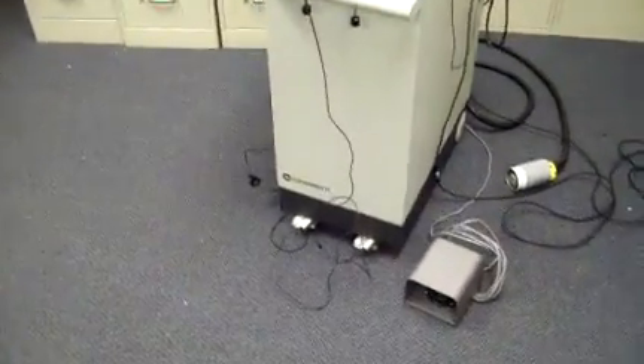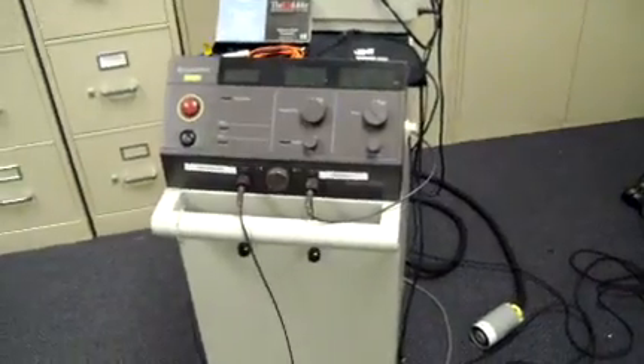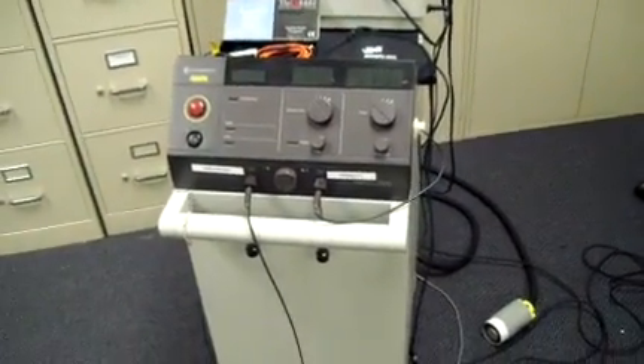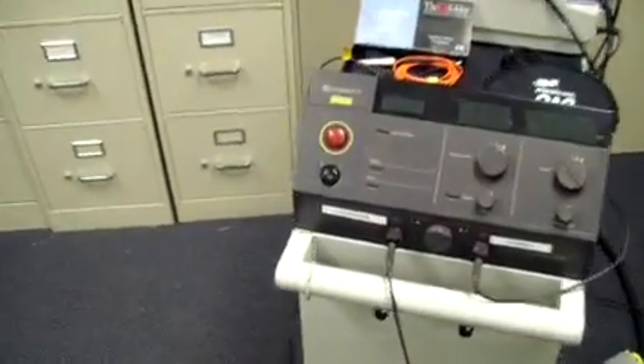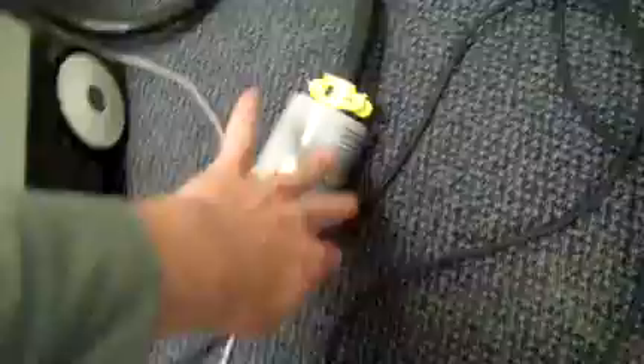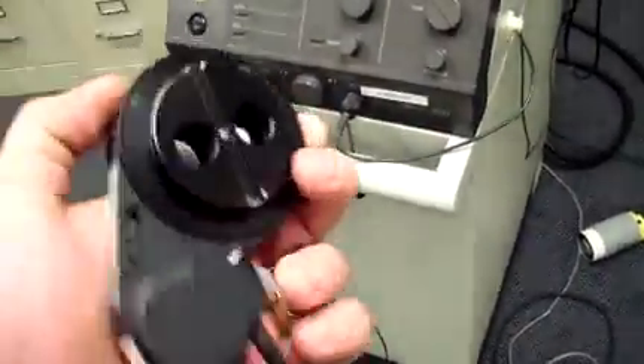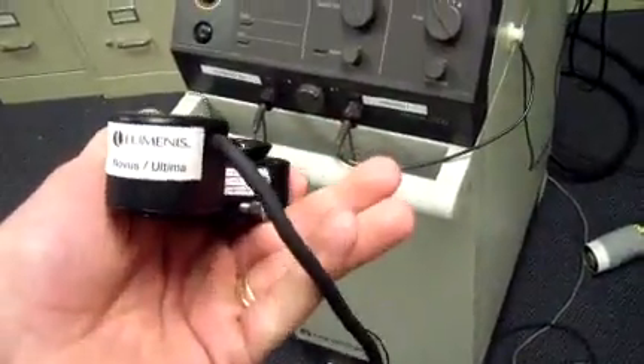Keith from DCSP Medical. We're looking at a Coherent Novus 2000 YAG laser. Just brought this in. I don't have a key for it and it takes a large power supply. It does come with the foot switch. There is an attachment for a microscope or a slit lamp.